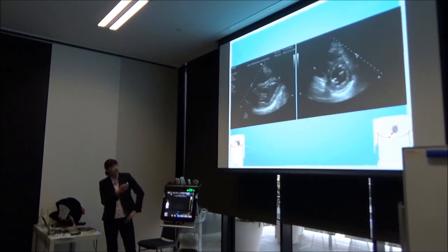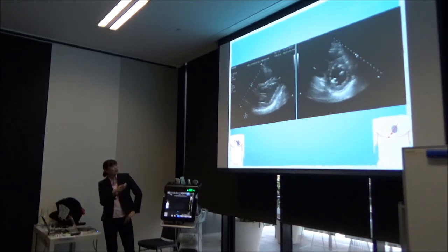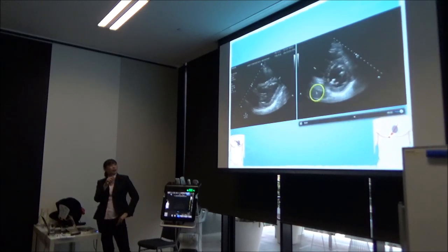So what we did was we started with inotrope and transcutaneous pacing. Between here, this symptomatic bradycardia, we transcutaneously paced as well as gave an inotrope, and now I get a parasternal short view that seems to be moving a little bit better than this one. Is it moving better in a symmetrical fashion?